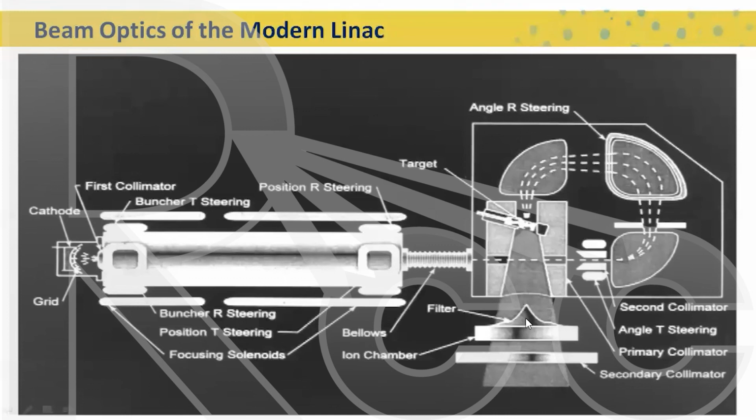Filter's made of tungsten. Take it out, gone. You don't have a flattening filter. You say, well, you need a flattening filter. How do you spread the beam out over 10 centimeters, 15 centimeters, 20 centimeters? You need a flattening filter. No, you don't need a flattening filter. You can treat with a very intense lobe, what I call almost like a bullet of radiation.